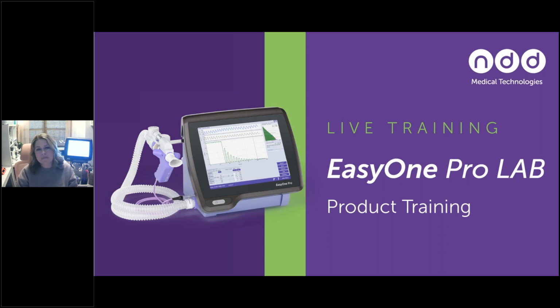Perfect. There's some conversation in regard to helping patients with facial muscle weakness or facial paralysis, that a mouth seal can be helpful in maintaining seal instead of a mouthpiece, especially in older patients. Yes. I think there's a physician on here, Dr. Maida, who has used micropore tape to close the mouth in case of facial weakness and has had success with that. So yeah, that's awesome.